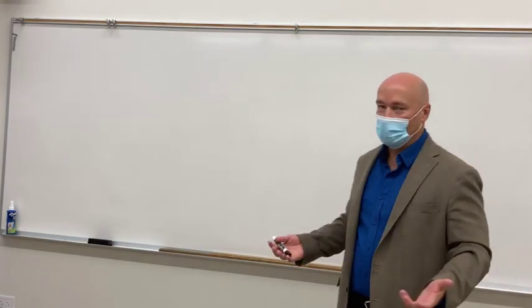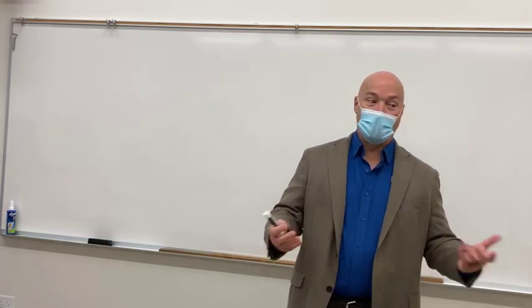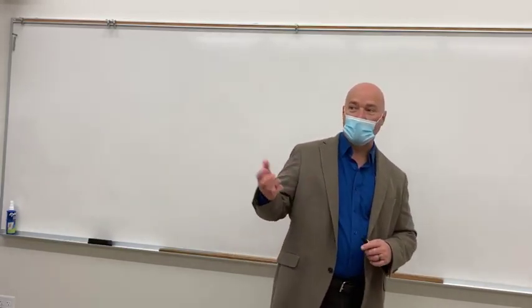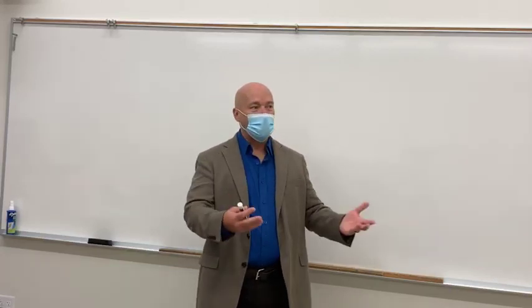If I were to shoot a chest x-ray with 10 KVP, what kind of KVP do we use for chest x-ray? 100 to 120. If we're doing portables, you may go a little bit lower than that, but very high KVP, right? So if I were to do that same chest x-ray with 10 KVP, what do you suppose we would see?